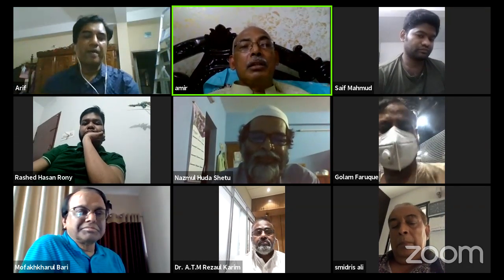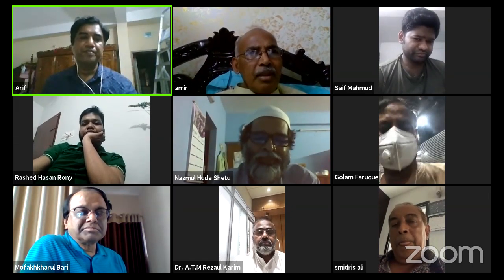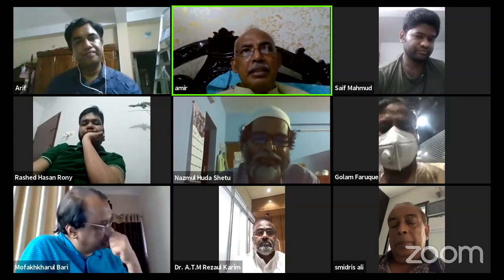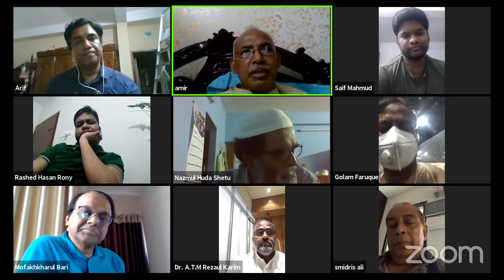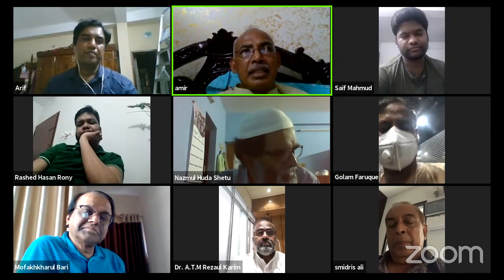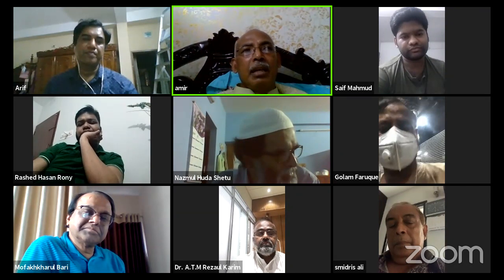Okay, thank you, sir. You said that in the subtalar joint, I think the main role of the subtalar joint is the rotation of the talus. So we must correct that talar rotation first, and then gradually correct the midfoot.